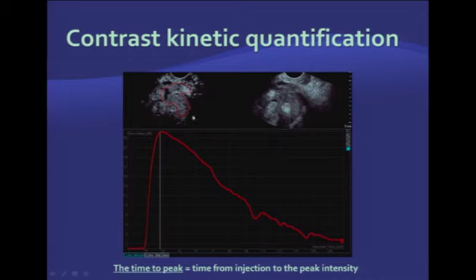After the injection, if you follow the microbubbles or keep scanning for a certain time, ultrasound images can be quantified. We can select region of interest that includes perfused areas in this tumor, and then computer will plot time intensity curves. After we have that, we can quantify different parameters and use them to make a diagnosis. You can calculate time to peak, time from the injection to peak intensity, which is very useful to detect cancers and also to judge treatment response.